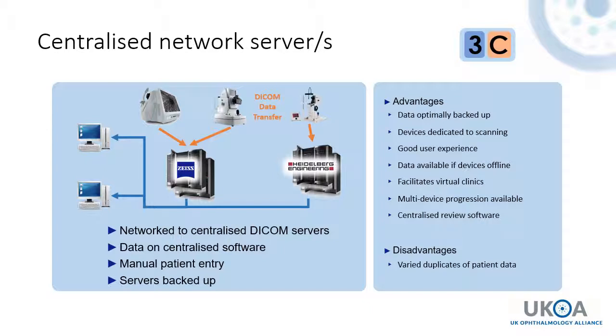carry out virtual clinics, though the concern can be because the data is still entered manually on the devices, you can end up with a lot of duplicates in the system for one patient, and that can make virtual clinics difficult because if you're launching your PACS product from your Ophthalmic EPR, your PACS product may not surface all the data available if it can't tell which data is from which patient because the data's all been entered manually. And that's the one shortfall of the 3C level of deployment, which is addressed by the 4C that I'll talk about next.